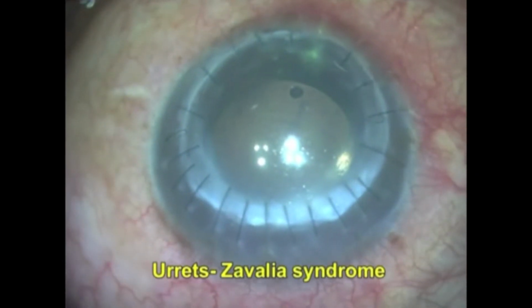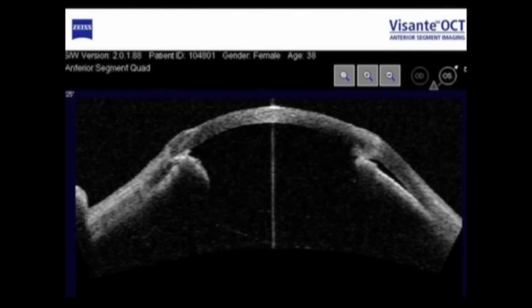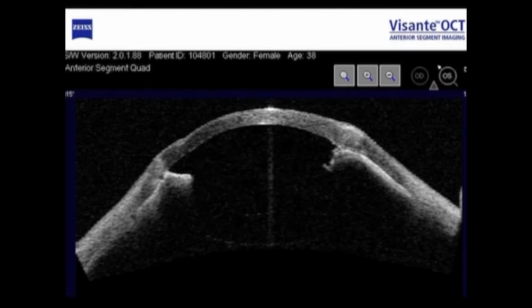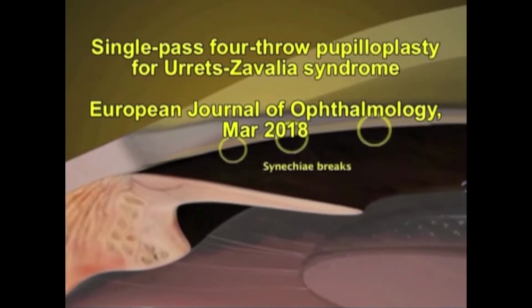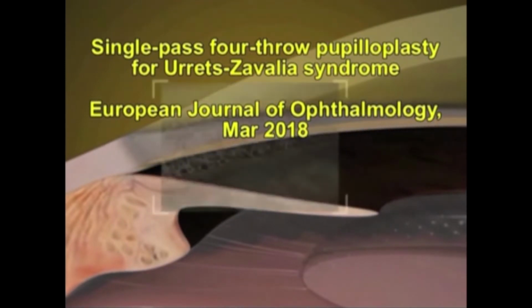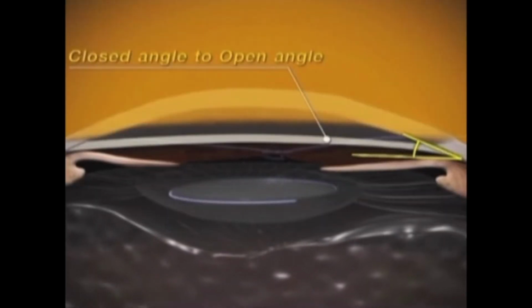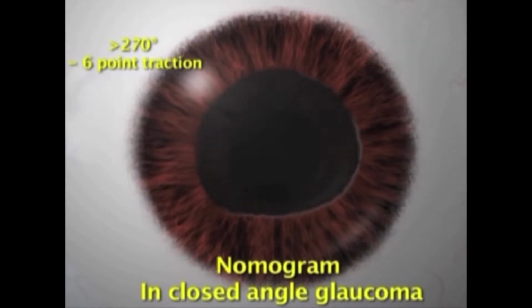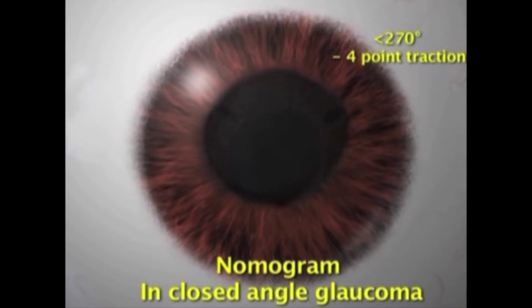Following penetrating keratoplasty, a closed-angle glaucoma can occur due to Urrets-Zavalia syndrome as seen in anterior segment OCT. The intraocular pressure is very high, with medication not helping. The solution is to open the angles by pulling the iris structure and then suturing the pupil together, thus making the angle from closed to open. We created a nomogram for Urrets-Zavalia syndrome. If there is closed angle more than 270 degrees, 6 points traction is done. And if less than 270 degrees, 4 points traction is performed.